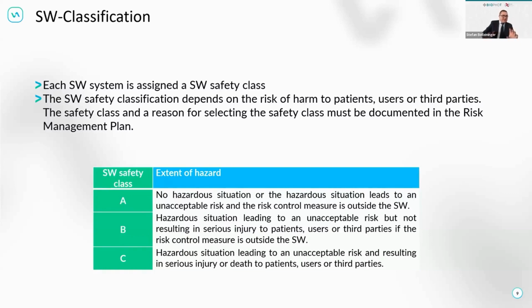Sometimes it is still a very good idea to document things, even if you're not legally mandated to do that. However, sometimes it's quite good to have additional knowledge in a particular product's documentation for the future, especially if you expect your team to grow quite fast. I would really recommend documenting a bit more than required by law, because that will help you maintain it correctly in the future and give you good information if your team changes and gets bigger and more persons are involved.